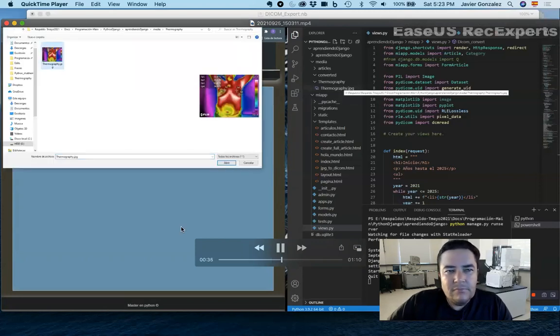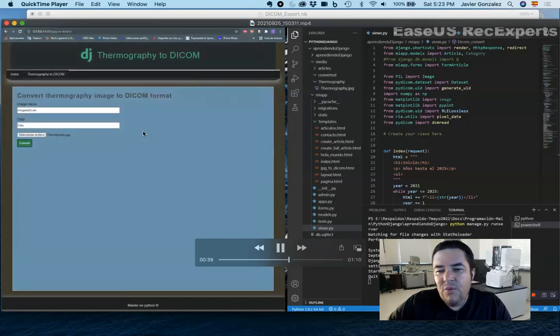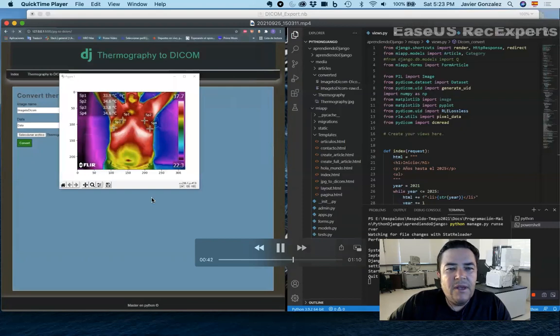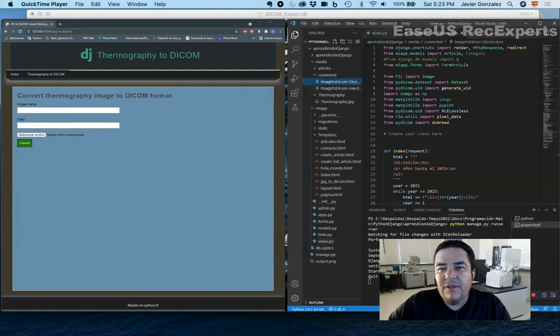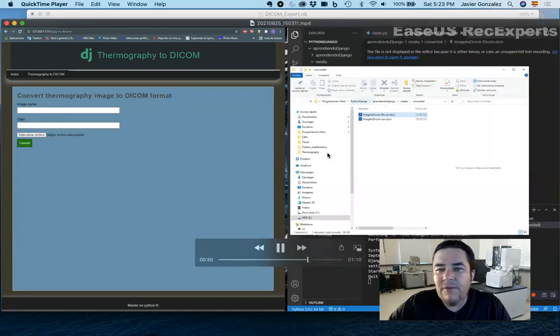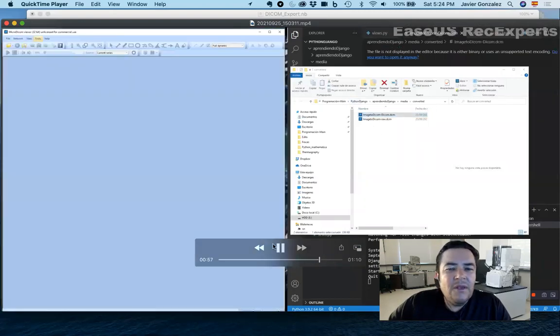So this is the thermography image, which is radiometric. And now it's converting the image into a DICOM file. Now that the DICOM file is generated, here it is. We can use this viewer.